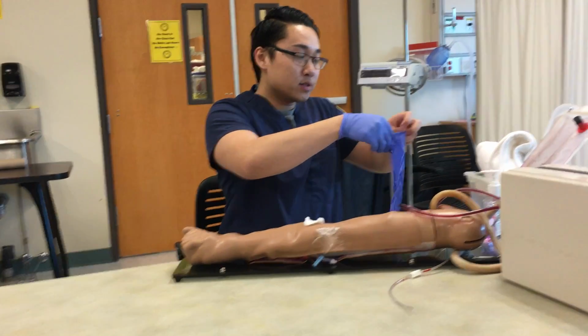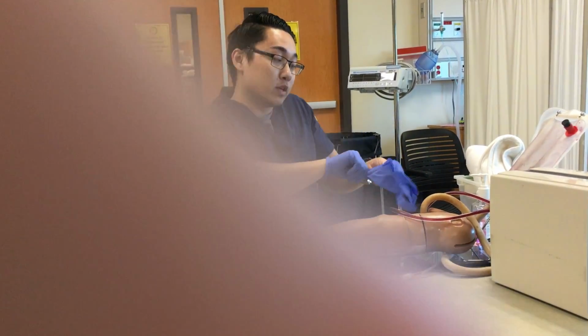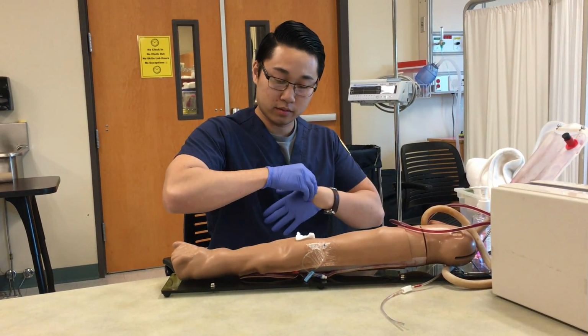And it's advised to go a glove size smaller so you're able to feel the pulse without having the glove get in your way.